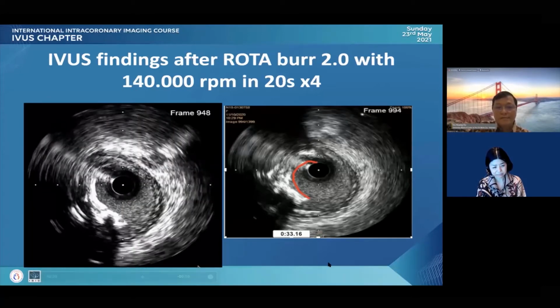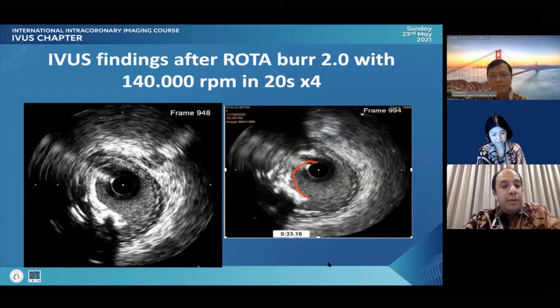Can I comment to Dr. Vu? Please. Yes, Dr. Vu, because I think this is a very big RCA, very dominant. Do you do some kind of preemptive pacemaker for this patient? Because I think the risk of bradyarrhythmia is quite high. But the other thing, I think there are a few case series regarding how to handle this to prevent bradyarrhythmia. Some experts practice by not putting in a temporary pacemaker, but using IV aminophylline, let's say 200 to 300 milligrams, just to prevent the bradyarrhythmia.